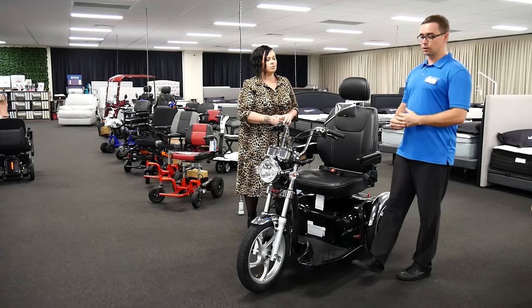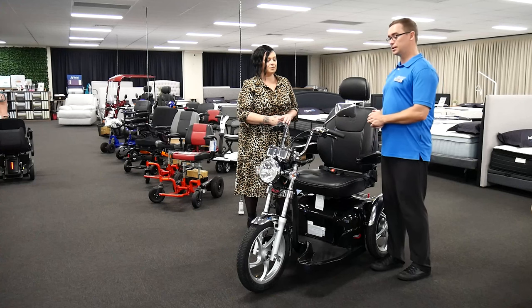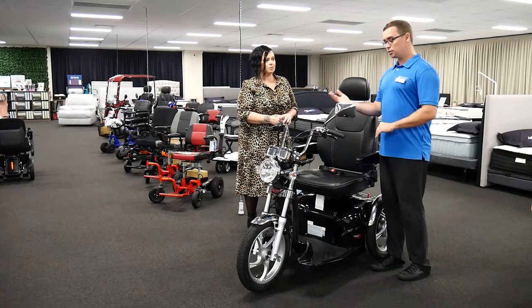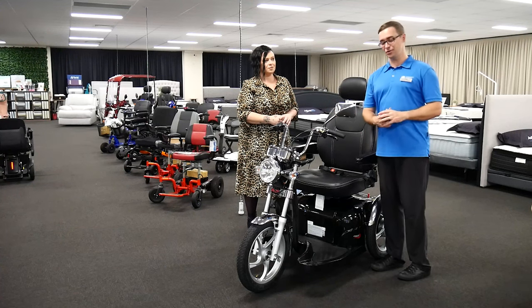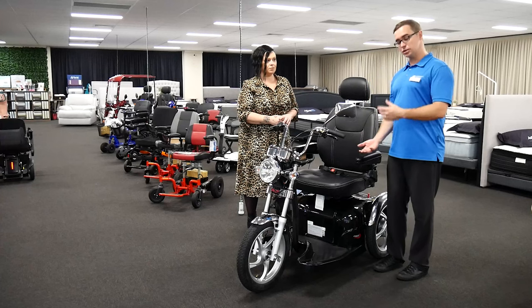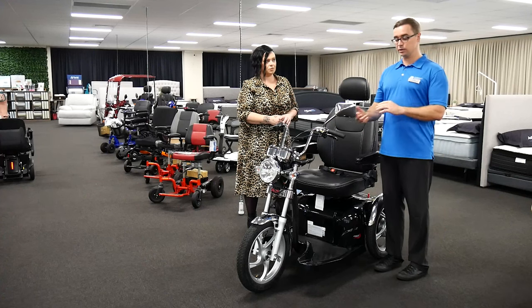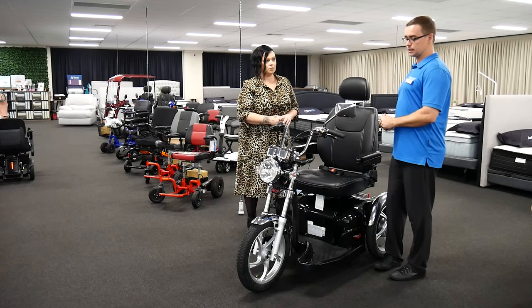We then move on to more of a scooter assessment, which is almost like a driving assessment — taking people through their ability to operate the scooter: turning, navigating obstacles, three-point turning, using the mirror, reversing. We also like to know where it's going to be stored at home. Do you have somewhere undercover? How are you going to charge it? An occupational therapist is really well placed to take their time with that and make you feel comfortable going through that assessment.